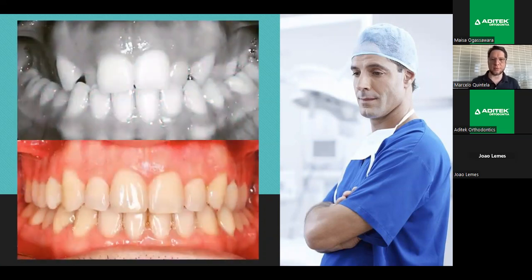Look at this photo. It belongs to our student here in the university in Santos. Look what she was able to do with a self-ligation system. And I thought she was doing that with a button on the palatal face of the molar and premolar, crossed elastics, and expanded archwire. All our archwires are expanded, from the first until the last. And look at the result.